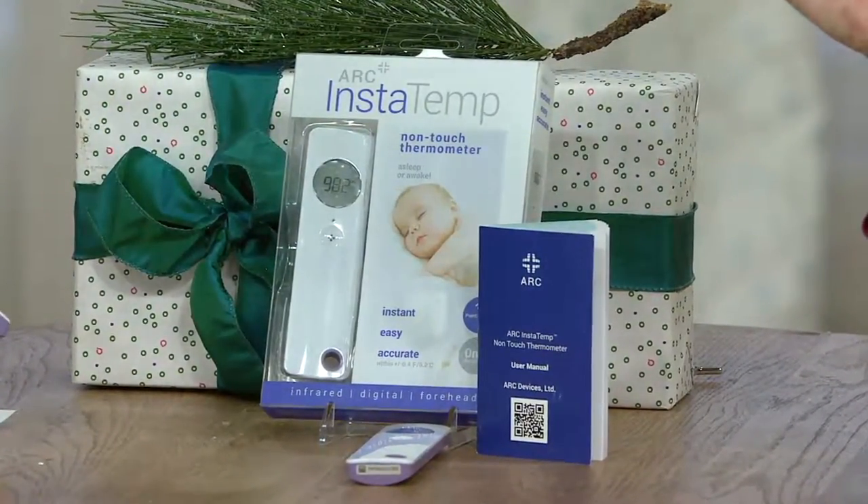It's fast. But most importantly, Janine, you were telling me this is clinically accurate. Clinically accurate — that's so important.